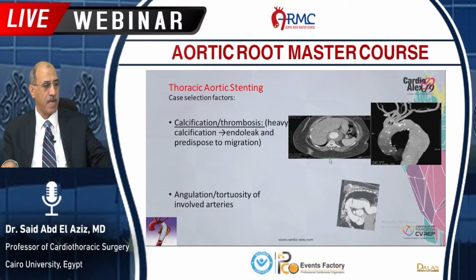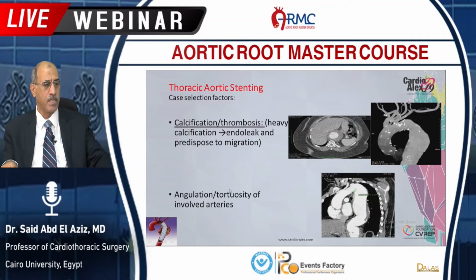And another factor is the angulation. The presence of many angulations and tortuosity in the descending thoracic aorta is one of the obstacles in TEVAR, and it might prevent good deployment of the thoracic stent as we like. Here we see that this is an angle at the diaphragm, and this is an angle at the mid-thoracic aorta, and this is an angle just before the arch. See, this angle is an acute angle.